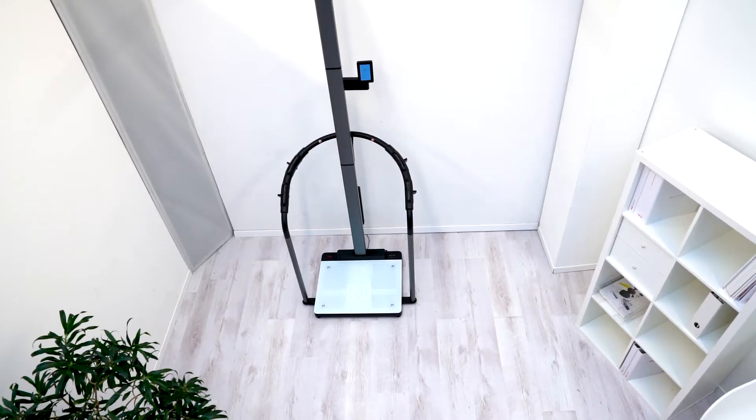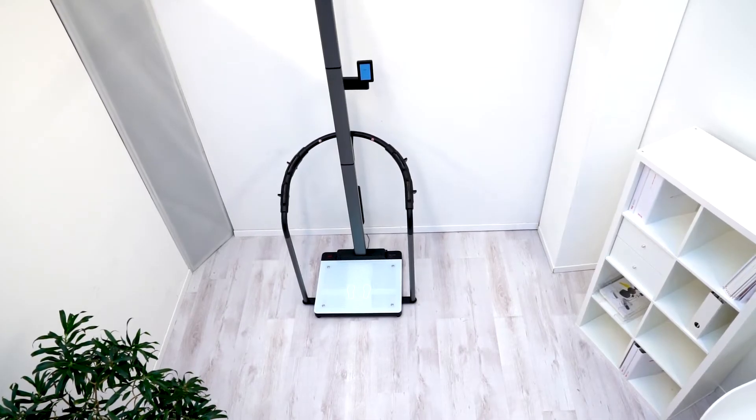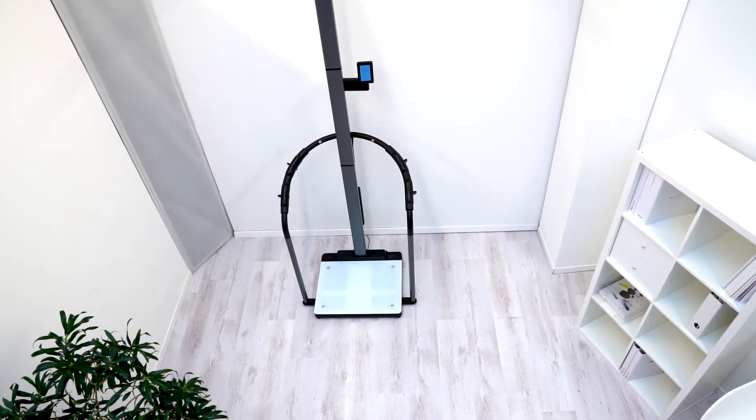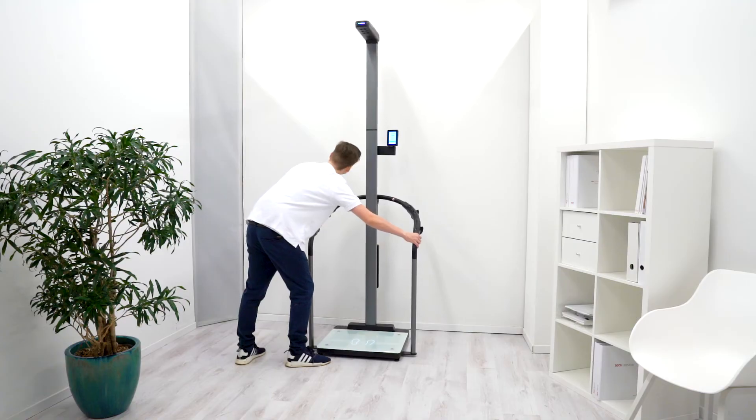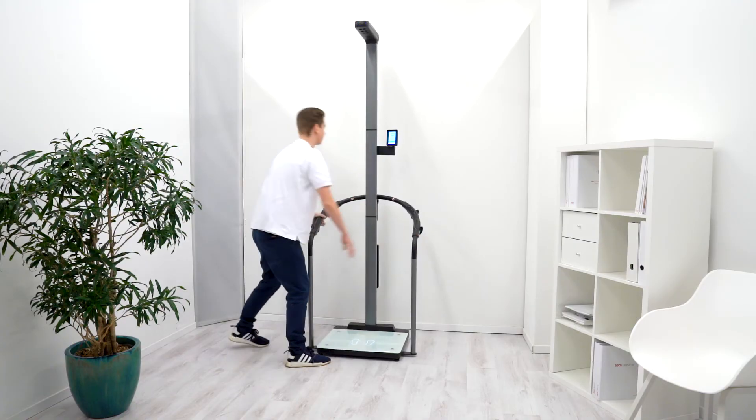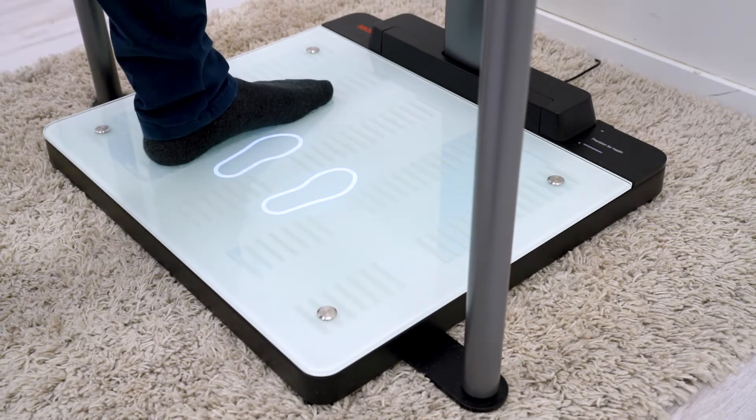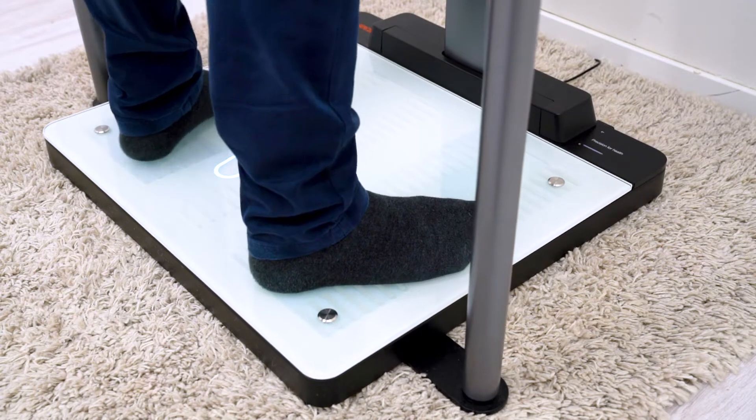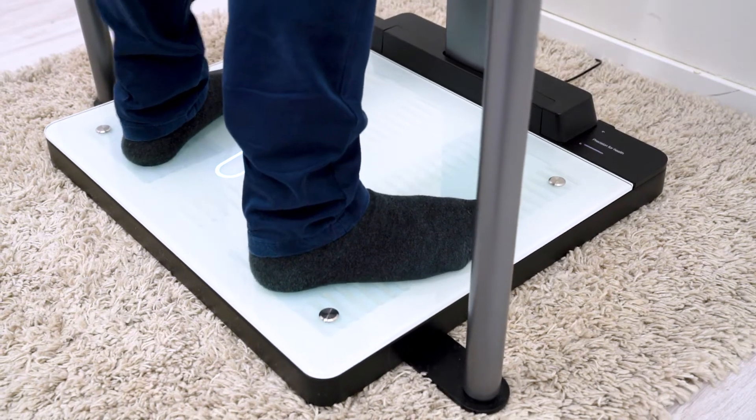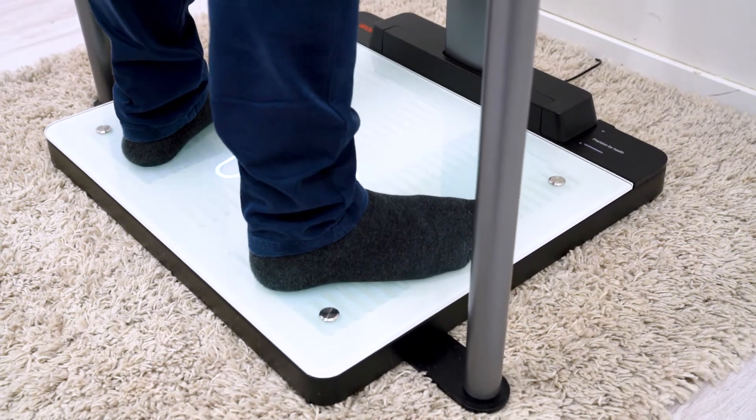The floor must be level and firm. Please avoid setting up on uneven floorboards or thick carpets as these may give way and thus distort the weight measurement.